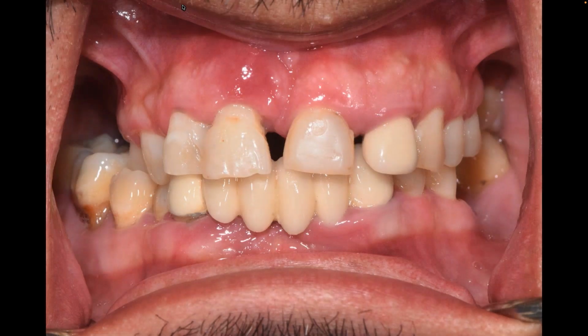look at this case. I actually saw this patient last week. Came to me, one of our immediate cases that we are currently doing with Friendship. So this is how the patient bites in MIP. And I thought it's a great case to show for this presentation so that you see how different the records can be between MIP and CR. Look at this. Look at the incisal embrasure between 24 and 25. Okay.